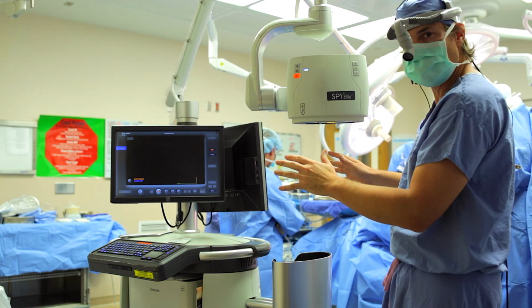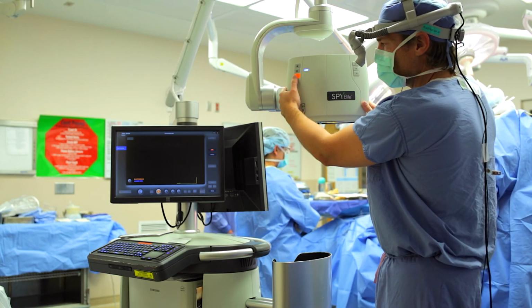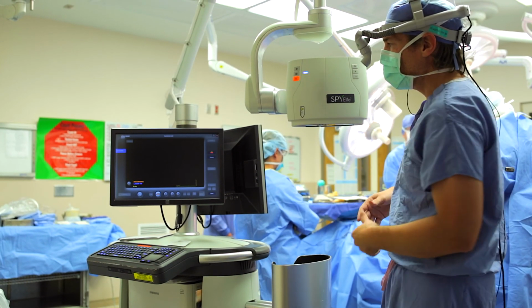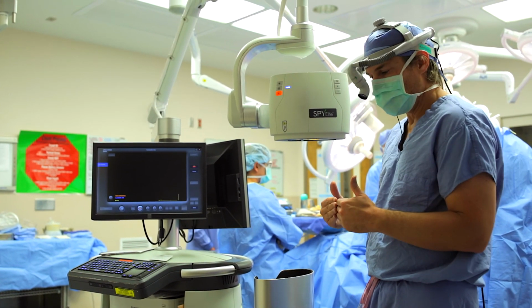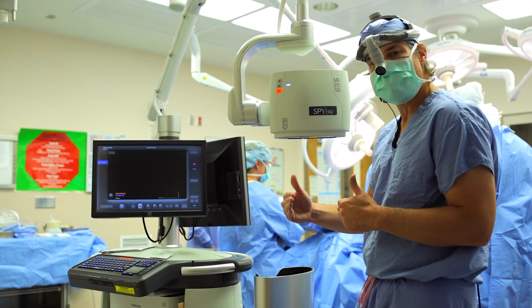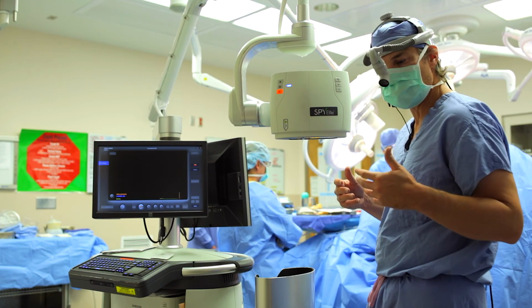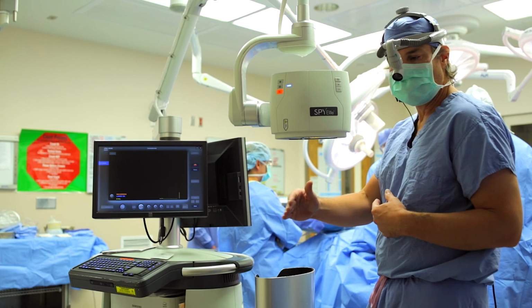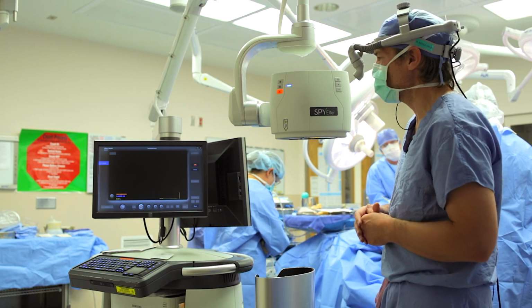To go from the buffering screen to live recording, you're going to hit this orange button a second time, and then all of a sudden that'll activate the recording process. Interestingly, it goes back and starts recording just a little bit before you've actually hit that button, so there's no delay. So as soon as you see white, you hit that button, it'll start recording about 3 seconds before you've actually hit the button. It's kind of a nice retroactive thing.